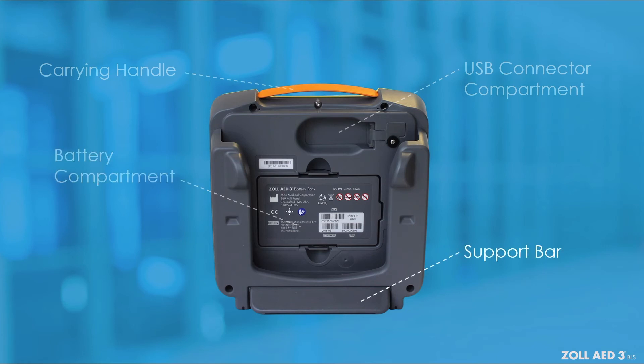The support bar automatically opens to hold the AED in an upright position for optimal visibility. The device has a dual orientation capability — it can be laid flat or stood upright, as the need to view the screen from various angles can change during a rescue.